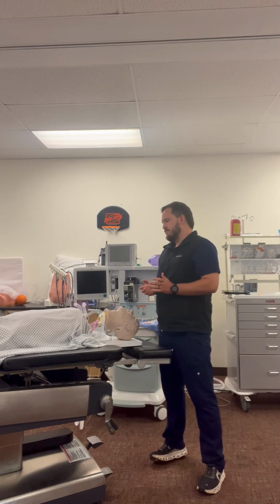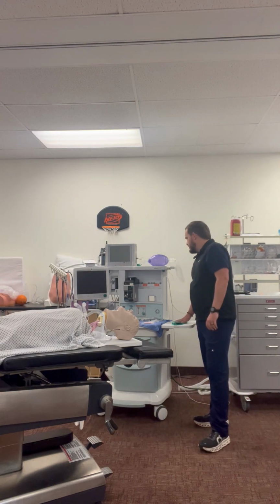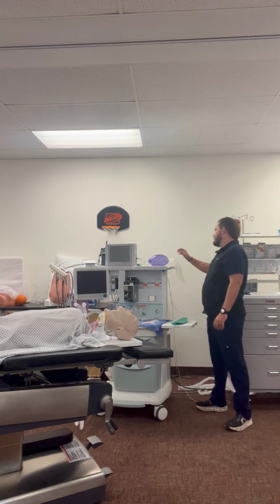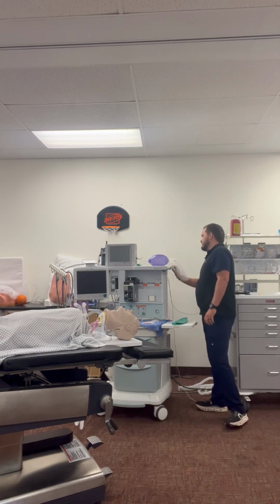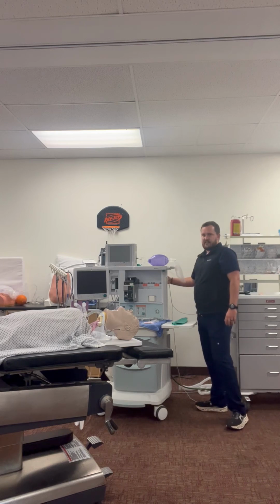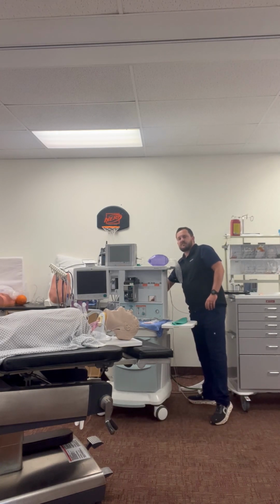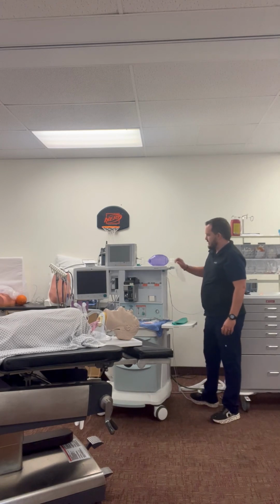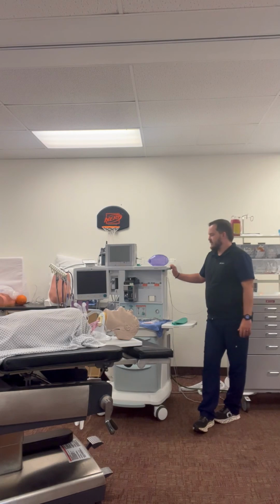Once I obtain consent, I'm going to leave the patient, go into the OR, do my machine check and room setup. So I'm going to come into the OR, make sure I have a BVM, make sure my monitor is here and that the machine is plugged in to the wall for power, and also that all my gas supplies are connected. I'm going to check the tanks on the back, make sure I have appropriate pressures in the tanks. For oxygen, I should have 1,000 psi, and for my nitrous, 745 psi. And then my wall supply should have pressures of about 50 psi in all of those.